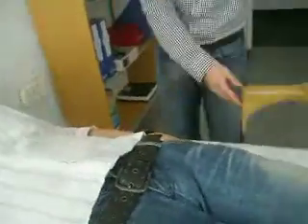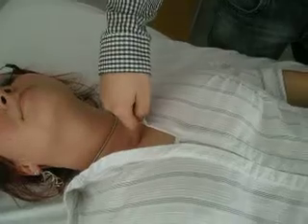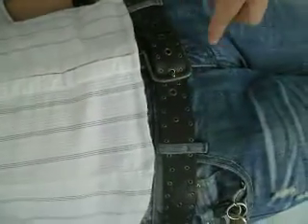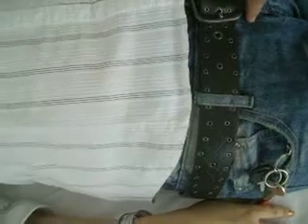Now the distance that I would like to measure is from the jugulum, which is the suprasternal notch. So this is the suprasternal notch, to the pubic bone, which is right here. You have to palpate it. So this is the upper edge of the pubic bone. Okay, and this is the distance that we are interested in.